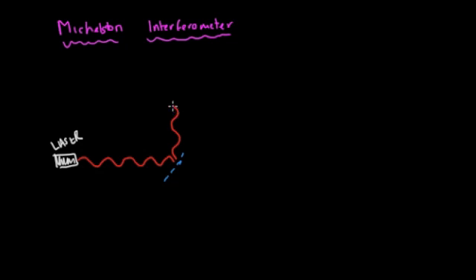And then actually, what I'm going to do here is trace this out so that we can split the light up. So this is the same beam of light, but it's just making this a little bit easier. Half of the light is then propagated straight through this half mirror and follows off to the right.